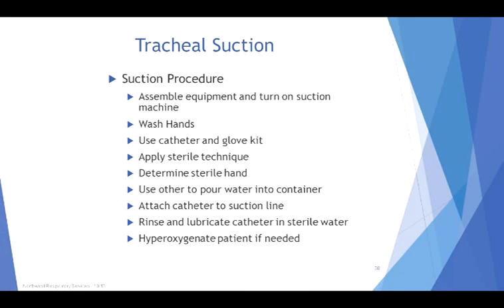Use your other hand to pour water into a container. Attach the catheter to the suction line, rinse and lubricate the catheter in sterile water. Hyperoxygenate your patient if need be.